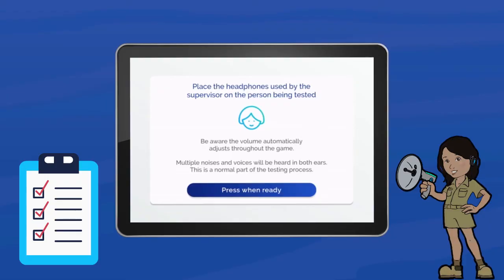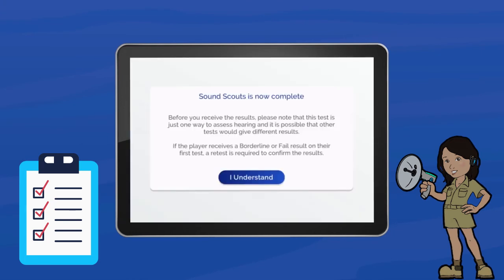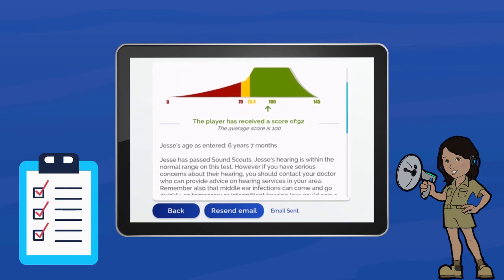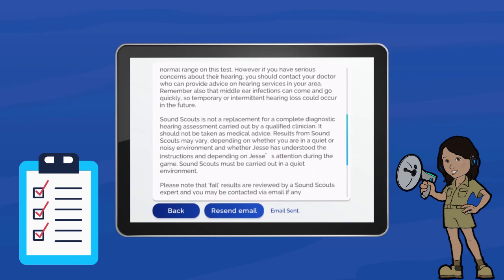Once the test is finished, you will receive an auto-generated report of your child's listening abilities. If the results indicate any hearing issues, we recommend retesting after 24 hours. If the child does not pass the second test, the report will provide you with guidance on what to do next.